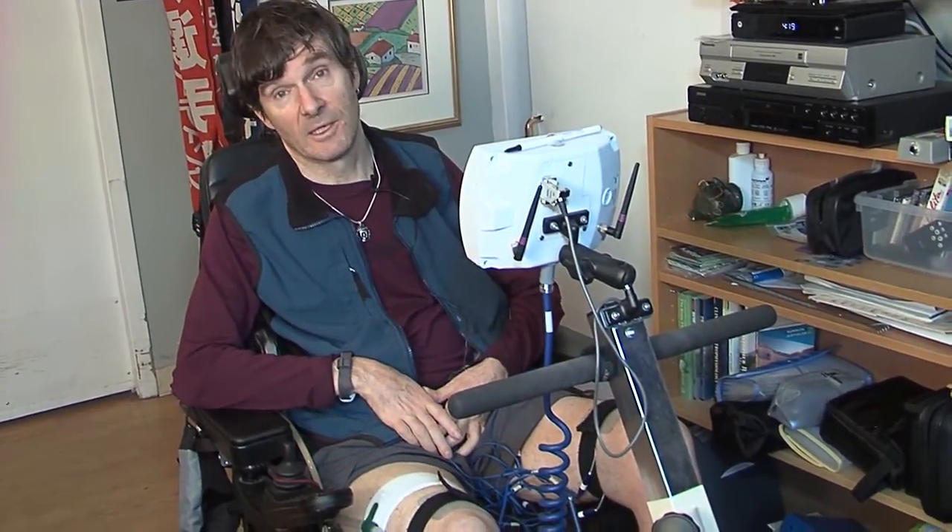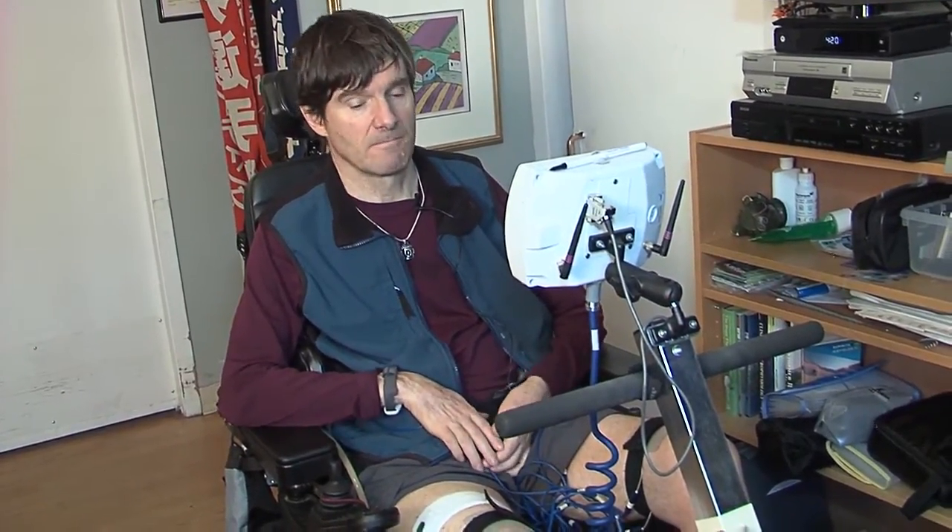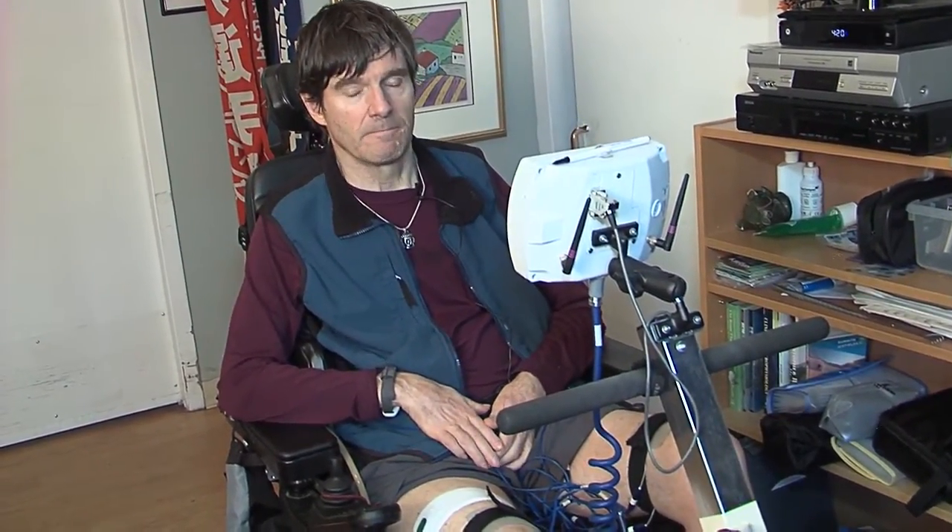My muscles were very weak at the beginning. My power output was about two watts, and that slowly increased over the course of a year to well over a hundred watts. It's important to be consistent and regular with your practice — that's the way to make progress.